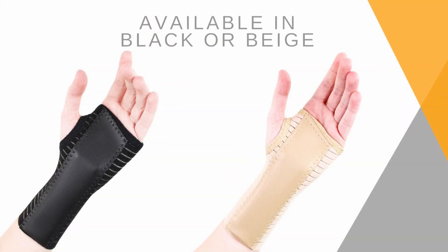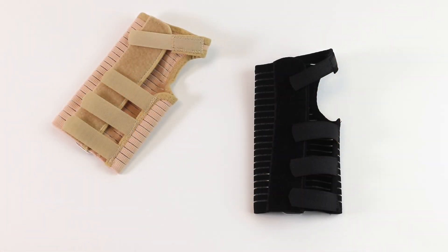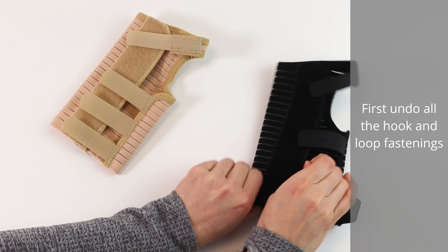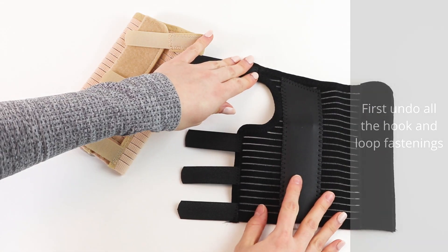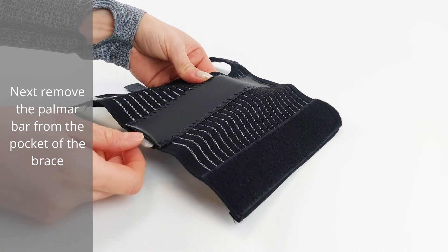Available in black or beige. First, undo all the hook and loop fasteners. Next, remove the palmer bar from the pocket of the brace.